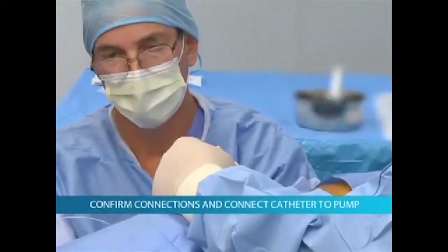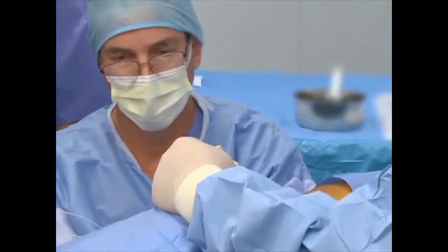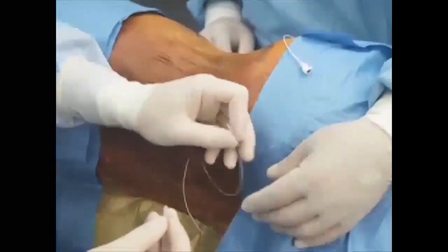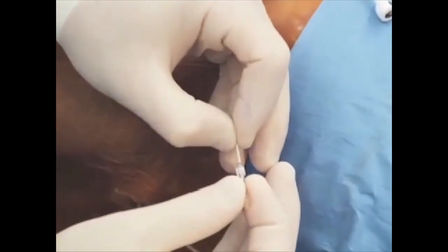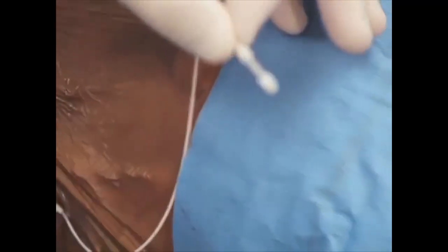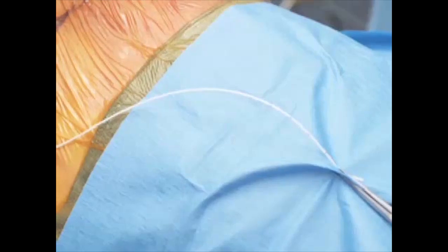Next, connect the two catheter segments. Note, if you're using a model 8780 catheter, you will only have one segment of the catheter to connect. To connect the catheter segments, locate the catheter connector and grasp the center of the connector. Insert the end of the pump segment into the hole of one of the collets. When doing this, the pump segment will slide onto a metal pin in the center of the catheter connector. Continue inserting the pump segment until you see the end of the pump segment past the collet, and the catheter will not insert any farther.